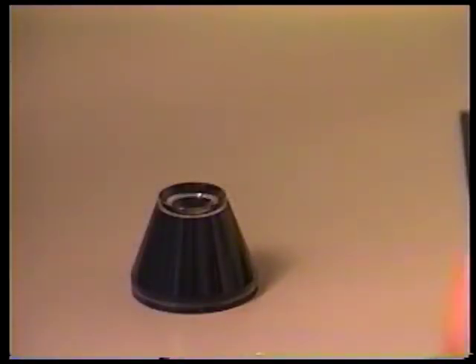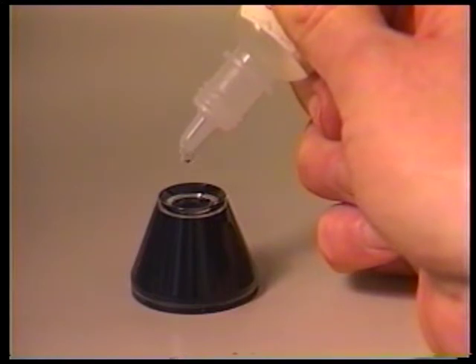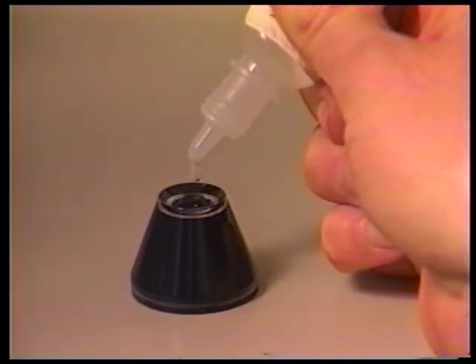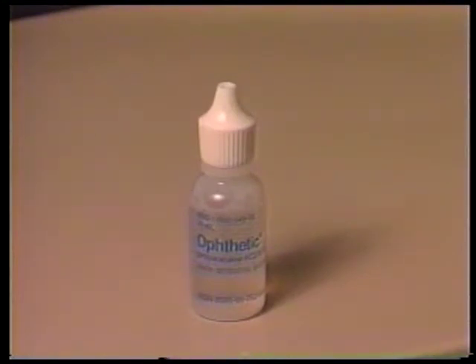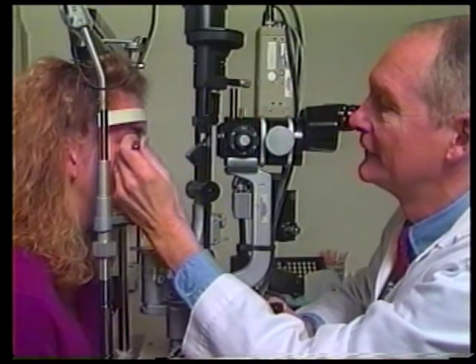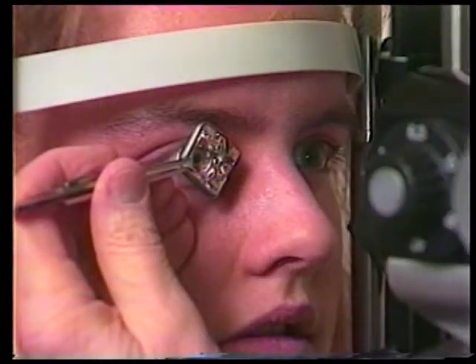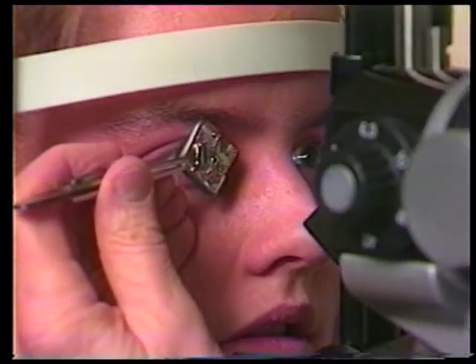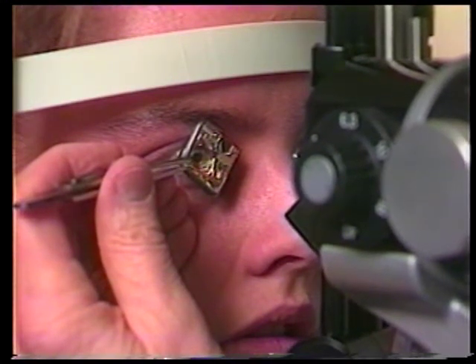In addition, a viscous methylcellulose solution must be used as the optical interface between the Goldman contact lens and cornea to obtain a clear view. Remember to use a topical anesthetic before placing any gonio lens on the eye. For all gonioscopy exams, you must stabilize the lens by bracing your hand and fingers gently on the patient's cheek and forehead while your elbow rests comfortably on the table or an elbow support if your forearm is too short.